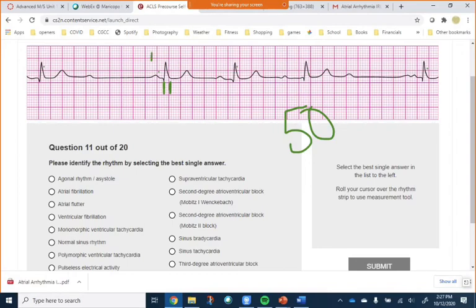So let's take this one. We're starting it here and going to here, mid box. So we got 1, 2, 3, 4, 5. So I've got about 5.5 boxes there. This one starts here and goes to here.